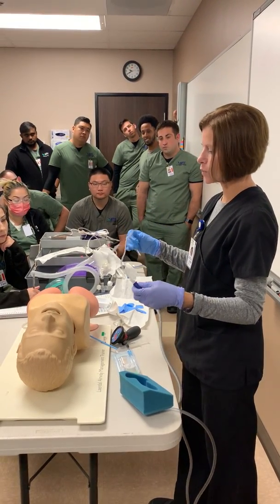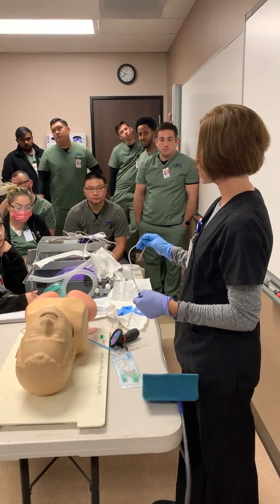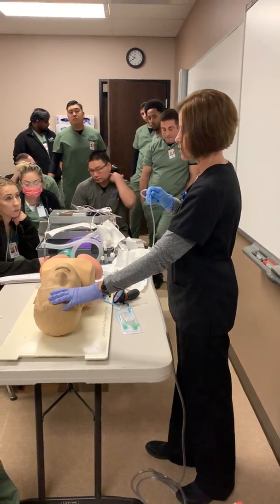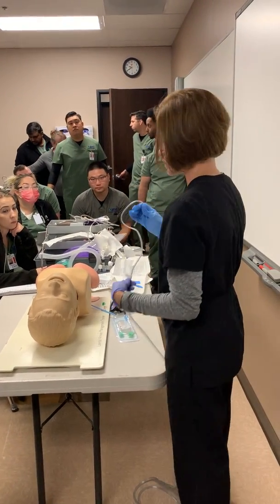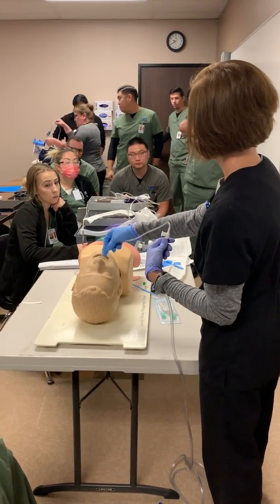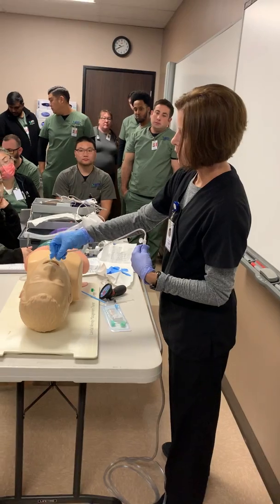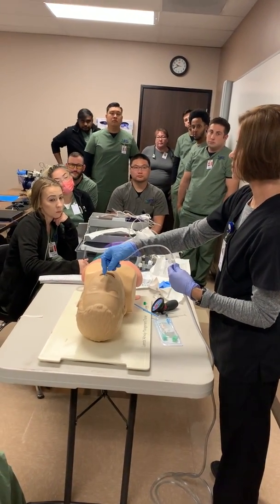If you're getting somebody who's kind of combative, take a nurse in there with you and ask them to help restrain the patient, because you are going to get people, somebody, like I said, that is awake and alert, and they're going to be thrashing around, they're going to be trying to grab at you. So sometimes you actually have to kind of come up from this angle and try to get the catheter in. If you can't get it down one side, go back, lube it up, try to go down the other side. If you hit a lot of resistance, then you stop.